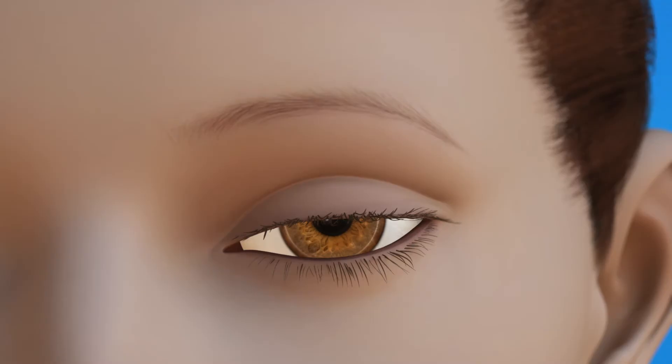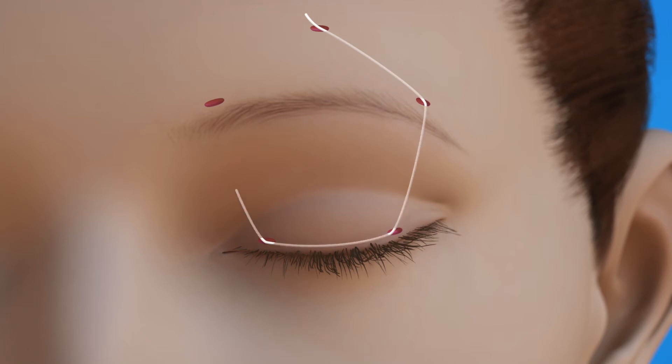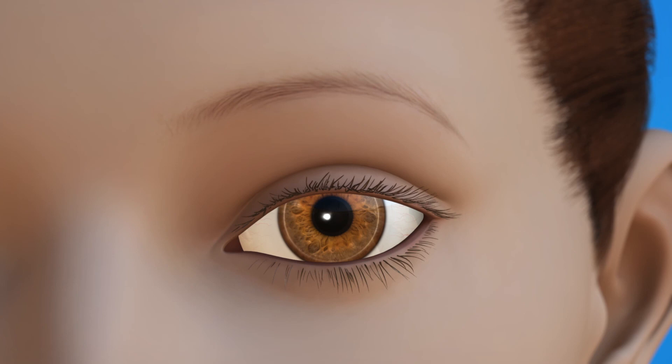During a frontalis suspension procedure, the eye surgeon makes a series of small openings in the brow and in the eyelid. Then the surgeon places a special material through those incisions and uses it to connect the eyelid to the brow. Once your child has fully healed, he or she will learn to lift the eyelid by using the brow muscle.